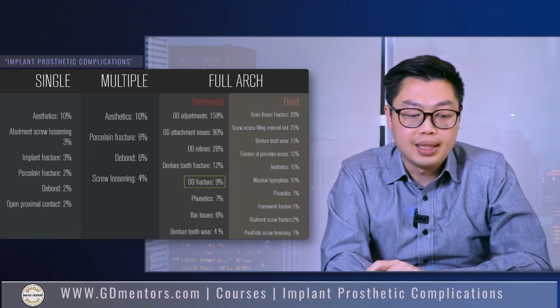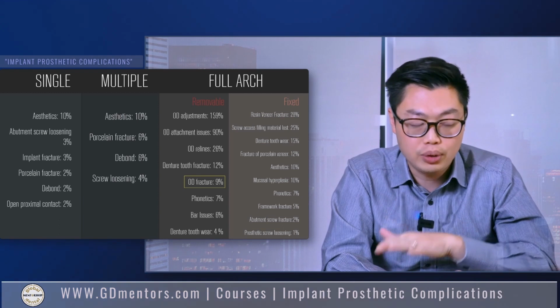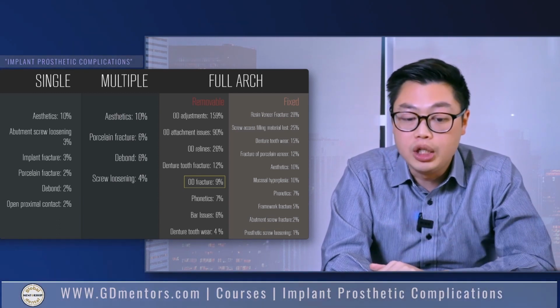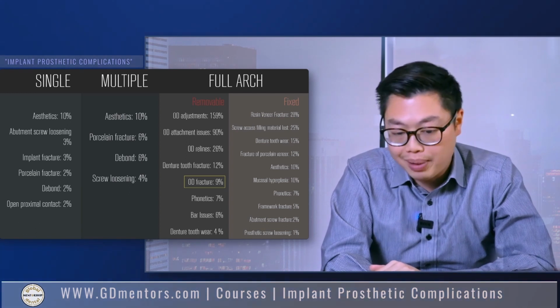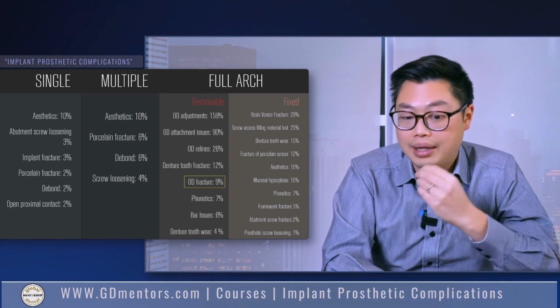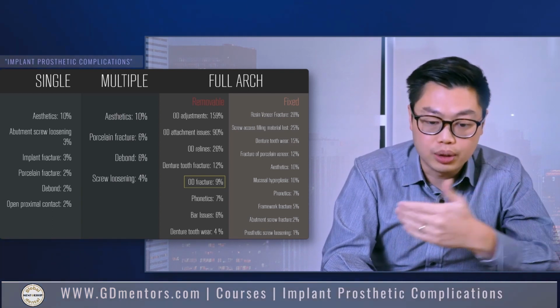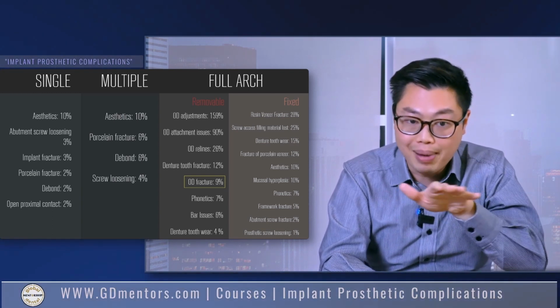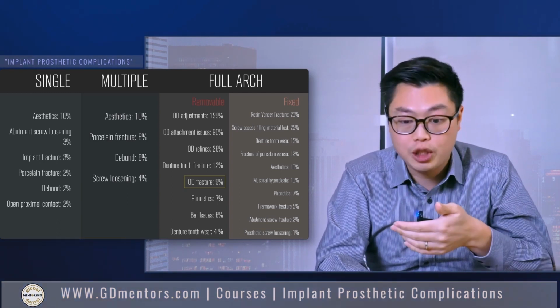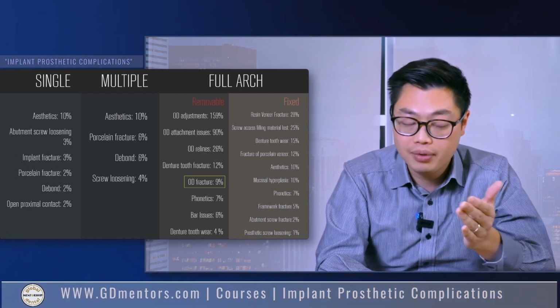If you're afraid of the denture snapping at the midline, then it's ideal to have a metal casted substructure underneath it. On the mandible, generally not necessary, but if the patient bites hard, if there's not a lot of reduction, if there's not a lot of ridge resorption, the prosthesis is not very thick, sometimes you can also do a mandibular metal substructure underneath, kind of embedded inside the overdenture. Obviously, this adds more cost, adds more space, but it will prevent fracture of the prosthesis in half.